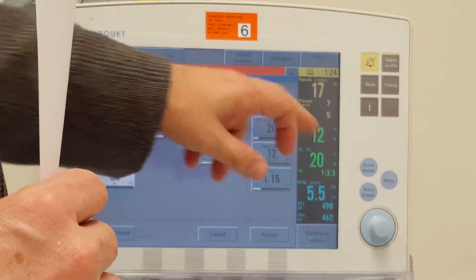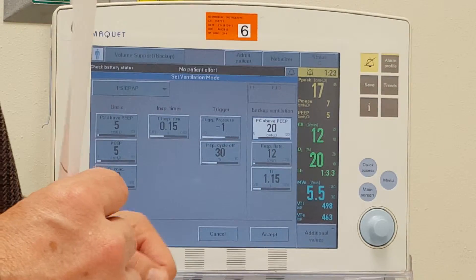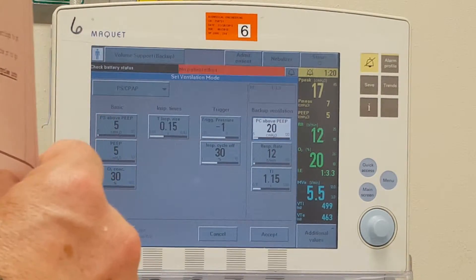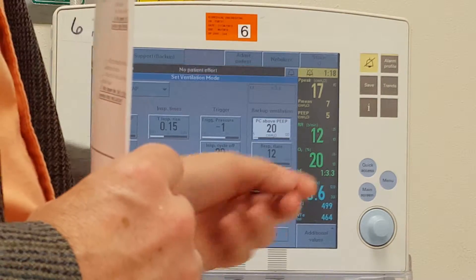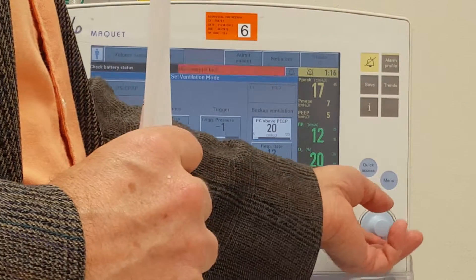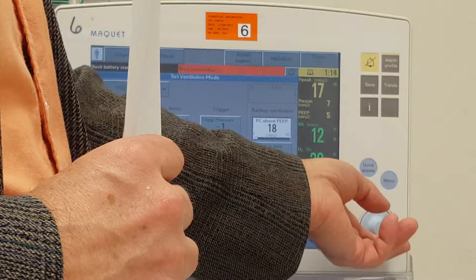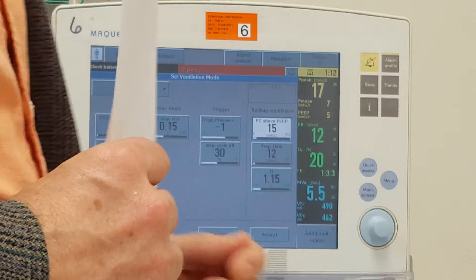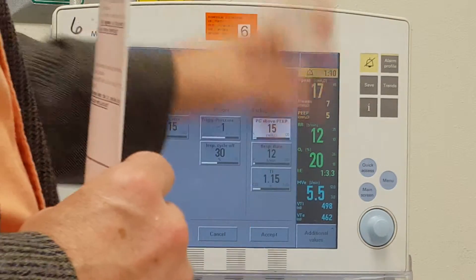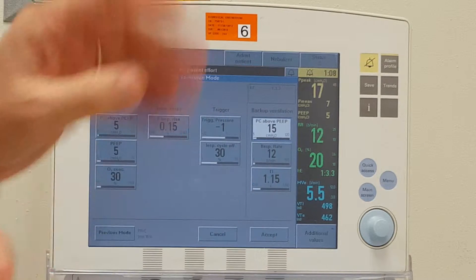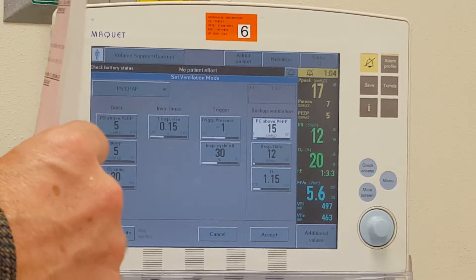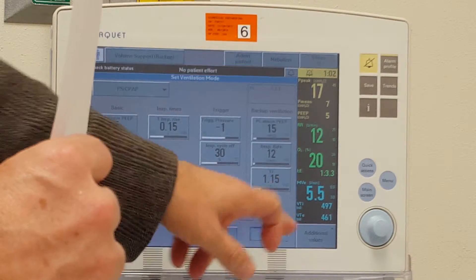Here we can see pressure control above PEEP 20. Let's put that down a little bit — let's try 15 and see how that does. This is the backup, so only if they go apneic will they get these settings. And let's hit accept and see what we get.